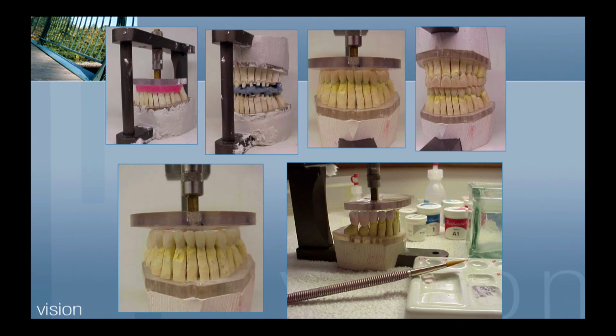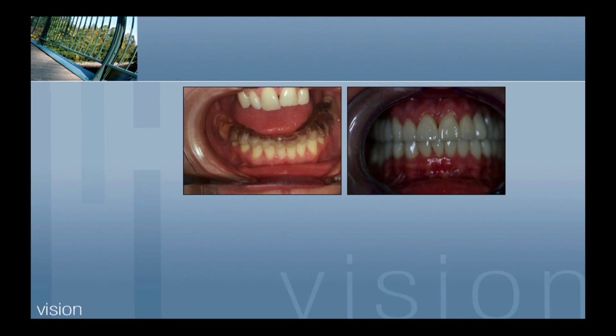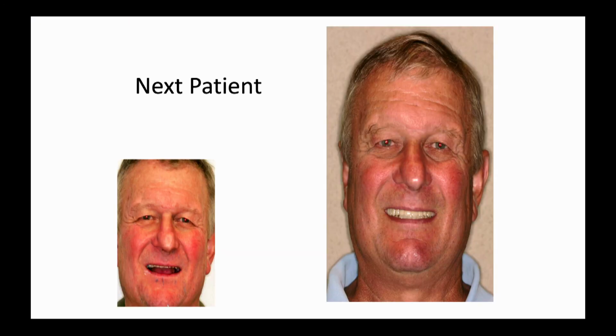And when you have something this complicated, the clinician that's doing the work has to be pretty accurate at what he does, and the laboratory technician has to duplicate that accuracy, or you've got a challenging case when you're all said and done. So that's how normally those cases would go. So if you're looking at this case, you went from that orthotic to that final position a certain way. It was done on an articulator with the bite transfers, with all those things that we always had to do to transfer this case.